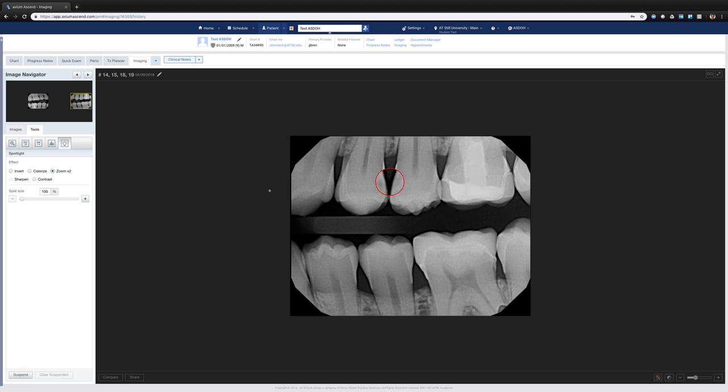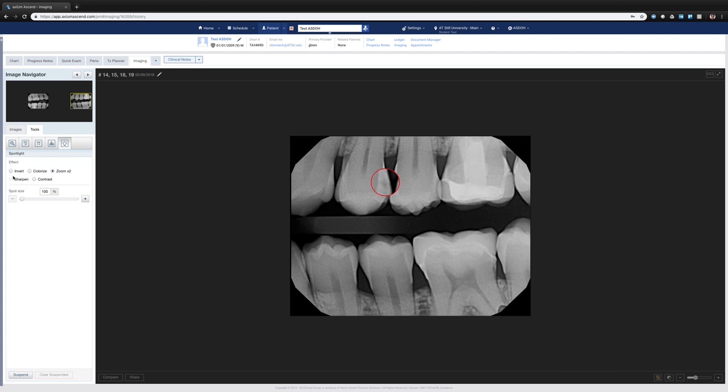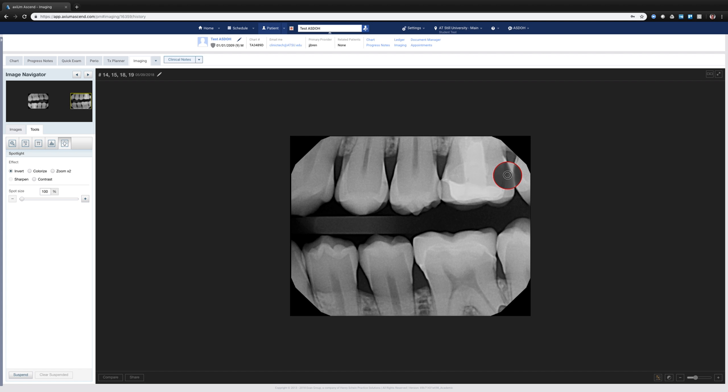Maybe I want to zoom in and just get more of a blown up, zoomed in view of what's going on there. I can invert that selection so I can see, do I get to see more clearly an open margin or some sort of curious lesion by doing that.